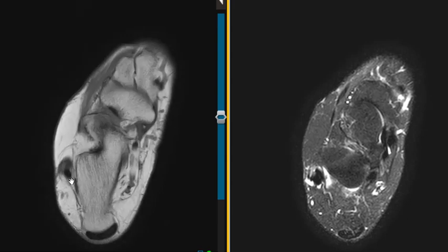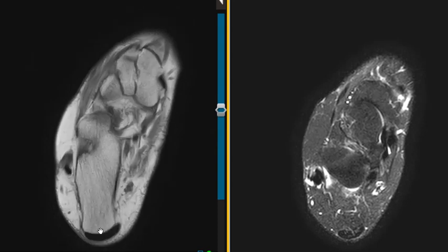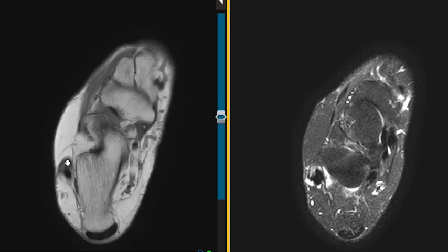But just to get back to the Peroneus tendon tear, if you're wondering about that, this is the Peroneus longus tendon, more posterior. This is the calcaneus or the heel, Achilles tendon. And again, this is the Peroneus longus in back. In front, we have the Peroneus brevis. And it should look very similar to the longus, but instead it's enlarged, ill-defined, intermediate in signal.